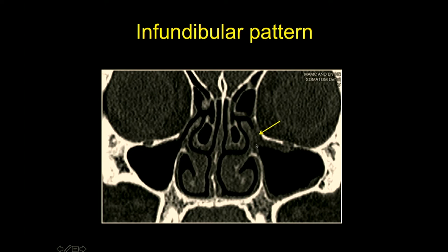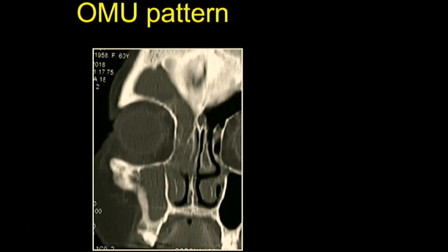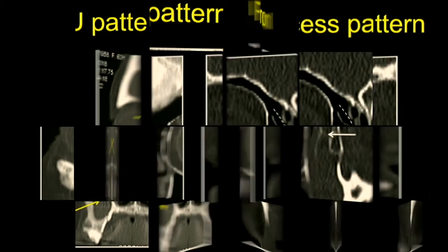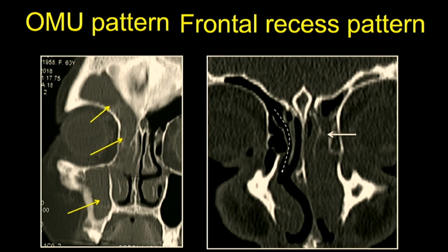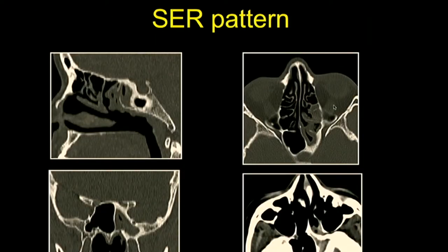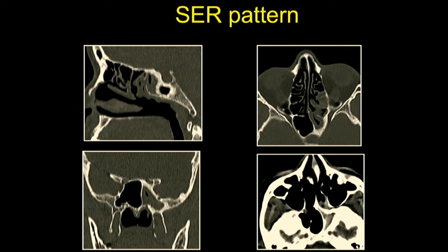This is the infundibular pattern of disease, where disease involves the maxillary infundibulum and there is mucosal thickening in the maxillary sinus, with the normal infundibulum visible on the right side. The OMU pattern involves the entire osteomeatal unit as a 3D space and obstructs the frontal, anterior ethmoidal, and maxillary sinuses. The frontal recess pattern involves the frontal recess on the left side, with the right side being normal, and hence disease is limited to the left frontal sinus.